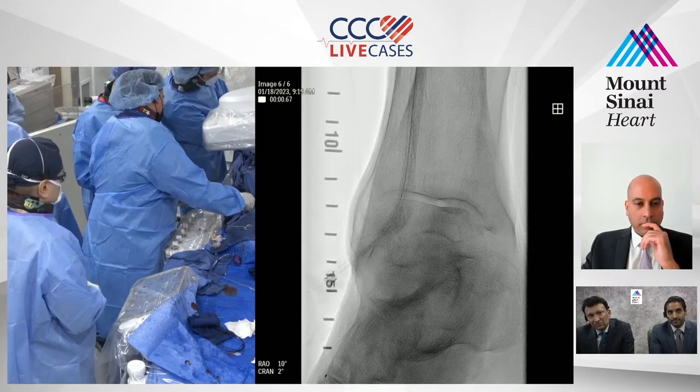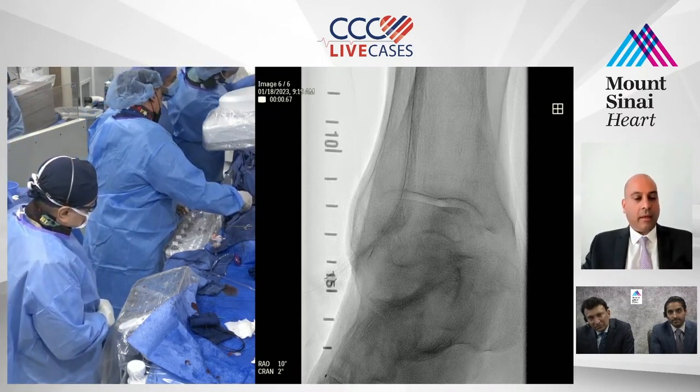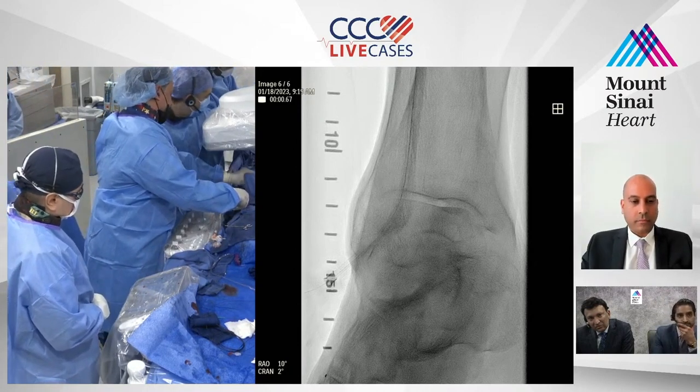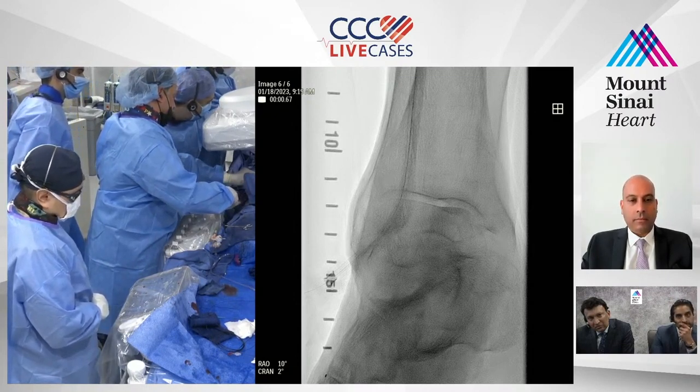I'm going to pull the catheter. You'll pull that catheter out. So now we talked about that. What's the plan now? Feed that to me. Let me hold pressure. Now feed it to me. Feed it to me, guys. Yeah, yep. Okay, here it comes. Yep, feeding. I'm pulling. Feeding.